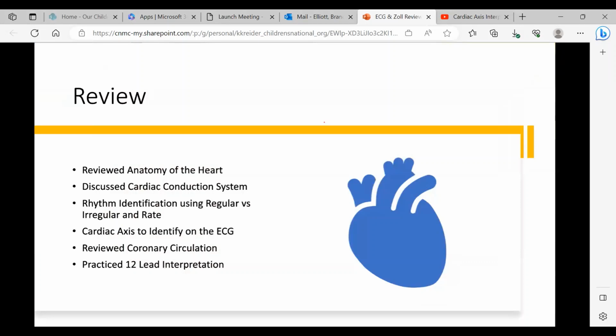Key points, what we learned today. Zoll, be mindful of the synchronized cardioversion in the right joule setting. So 70 joules for an adult for the Zoll. Yeah, I didn't really know that. Then we talked about cardiac axes. Sometimes it's good to verify the axes, because if you've got an ugly EKG, you'll know why it looks ugly all the way through. Because you turn the axes, as well as this bunny ear situation, these bundle branch blocks that you guys get caught up on.